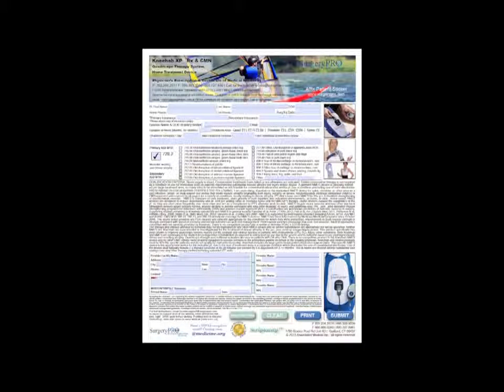So I might even rename it as my group Kneehab Master. And then I could even create a backup thereof. I have 2 of those files. And then every time I enter a new patient's data, I will simply title it separately. So I'll do a save as, title it unique to the patient, and then I haven't overwritten the original file. So that enables me sort of a shortcut.